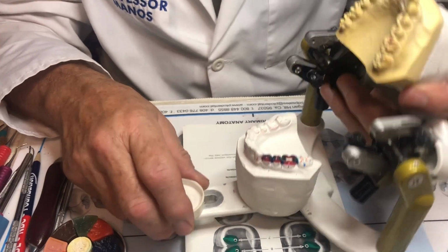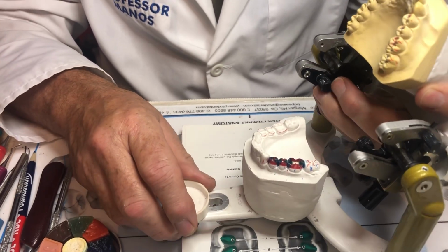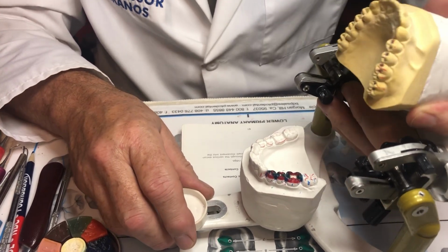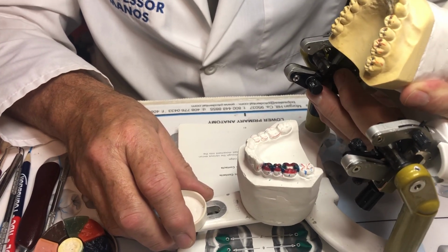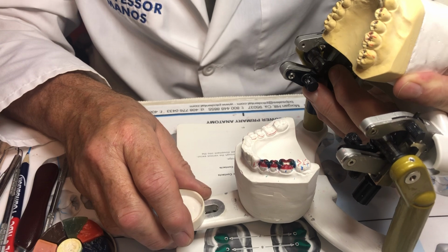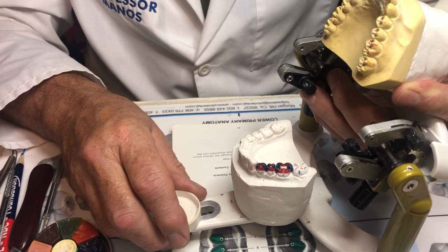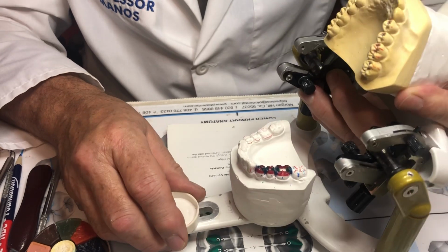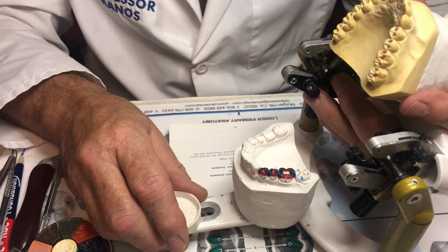Hello everyone. In today's video we're going to continue our Peter K. Thomas gnathological waxing of the mandibular posterior teeth. As you remember, we have two premolars, first and second, and then a lower first molar, 5 cusps. Make sure you start learning all of these, how many cusps, who's the biggest, who's the smallest. These are all questions on the National Board exam.